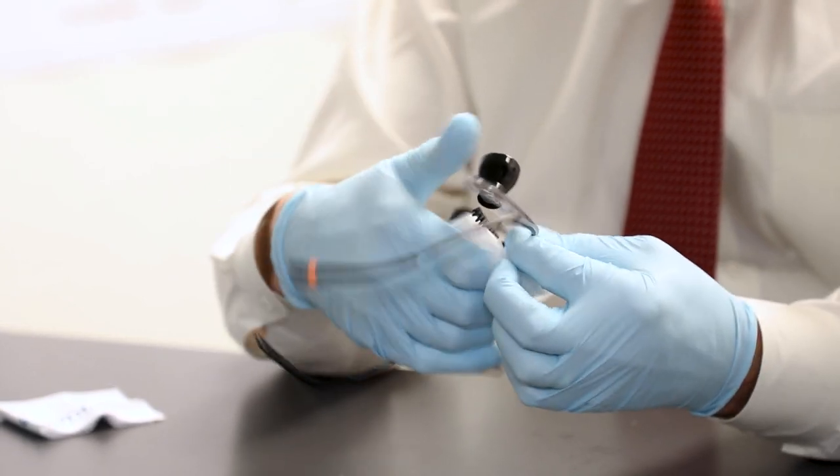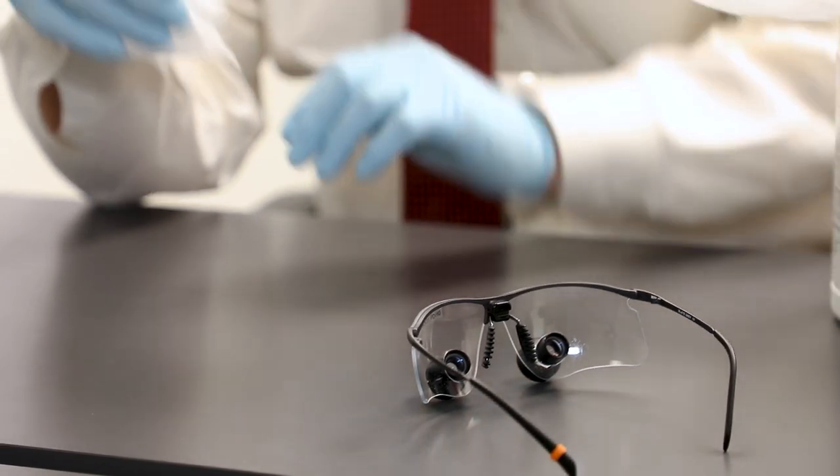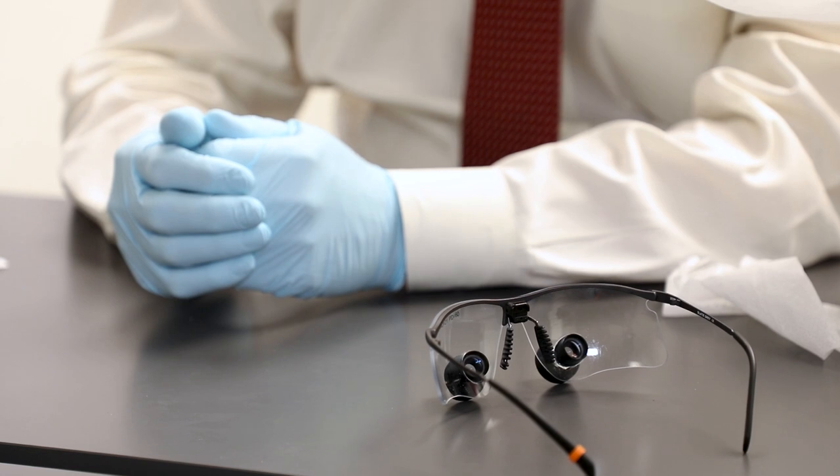Then you need to place those to one side and let them air dry, which usually will take in the neighborhood of 30 seconds to a minute. Don't wipe them off. You want the material to stay there because it takes a period of time to work.